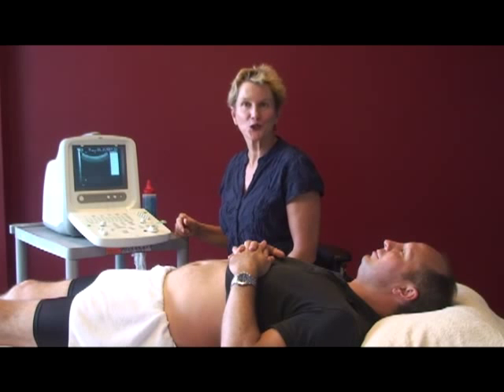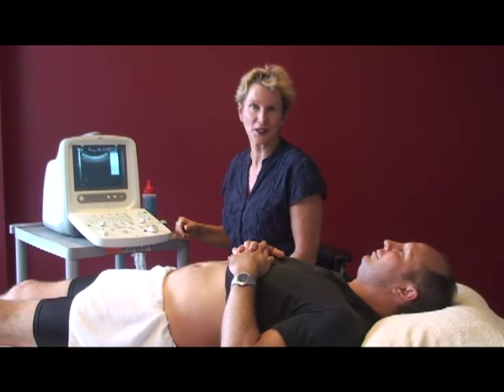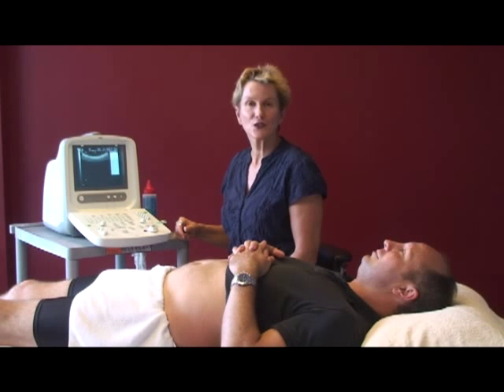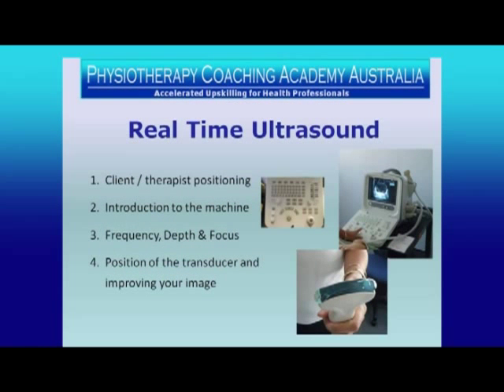What we're going to go through before we even assess any muscles is some of the important considerations required to use real-time ultrasound in clinical practice. There's 4 important things. The first is your client and where you are and where the machine is, so your positioning. The next we'll look at the machine in more detail and the transducers.